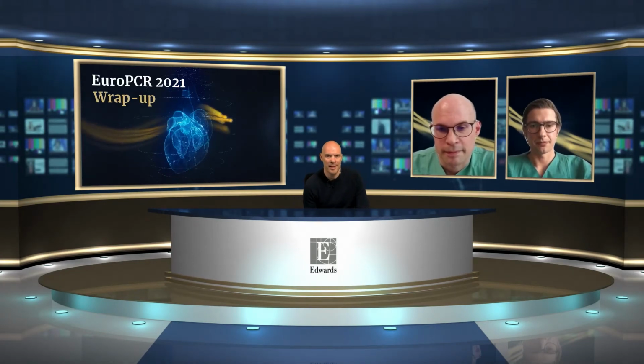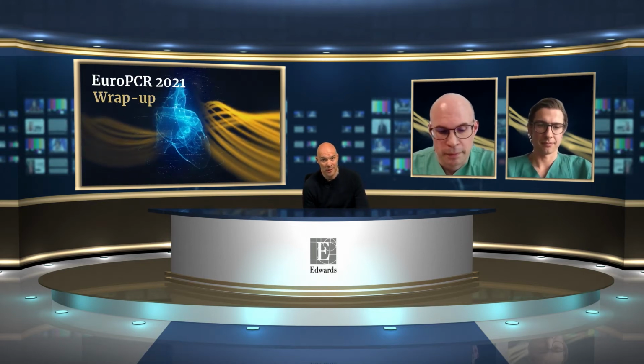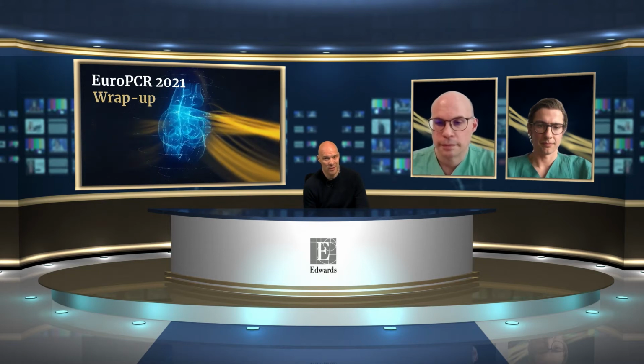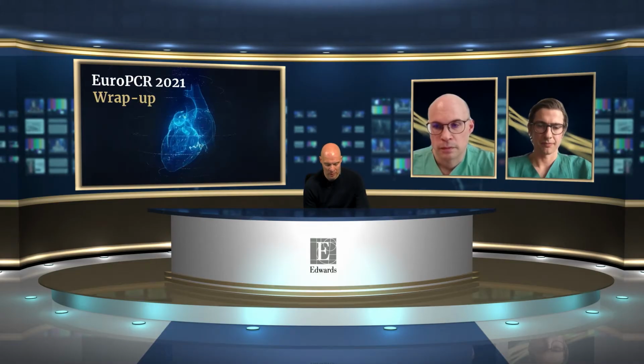Wow, I think this data clearly shows how elegant this technology is also to treat the tricuspid valve. The tricuspid valve is a different animal than the mitral valve. I think that was clear from Philippe Lurtz's presentation. I was impressed by the effect on the residual TR. Over 80% of the patients had moderate or less severe TR, so that is quite impressive. Is this patient selection? Are there patients that we need to avoid, Philippe Lurtz?